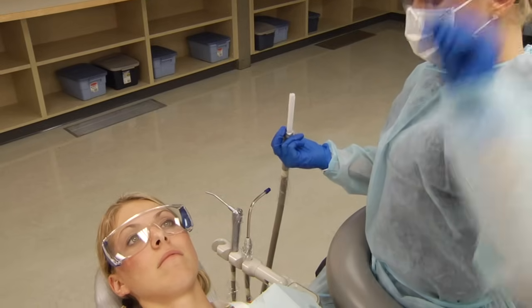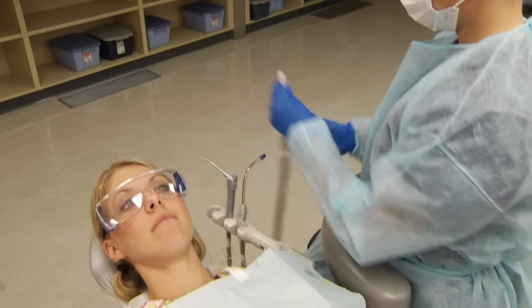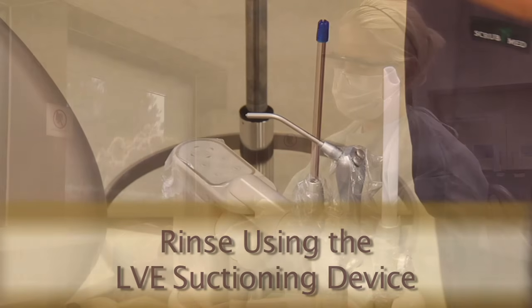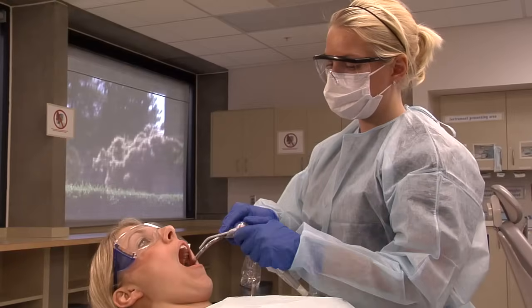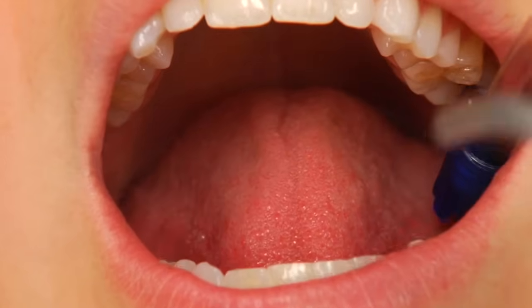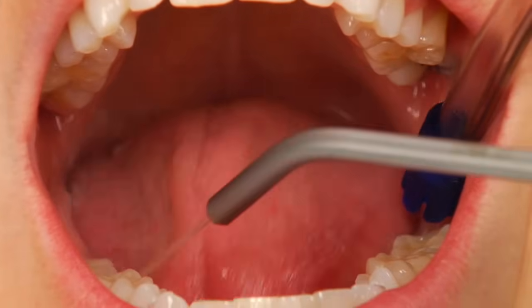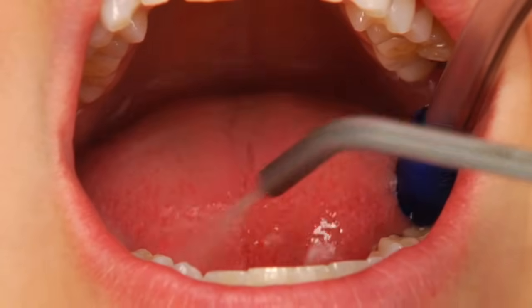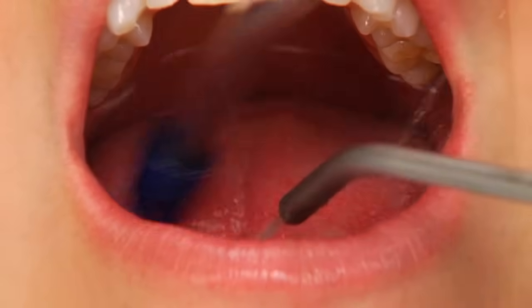Turn light on and direct the light into the patient's mouth. To rinse a bad taste from the patient's mouth, the assistant should use the LVE suctioning device. Held in the right hand, the assistant places the LVE tip into the patient's mouth and activates an air water spray to rinse back and forth across the patient's tongue.